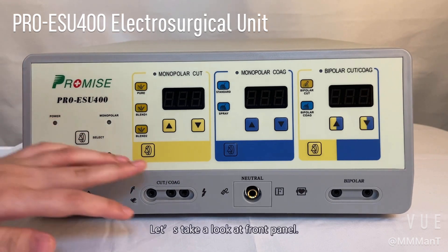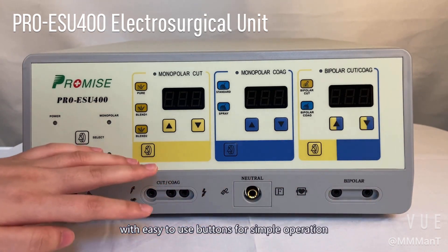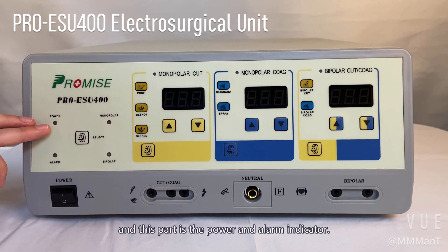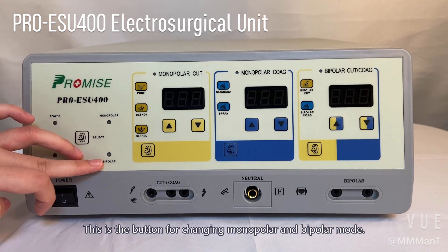Now let's take a look at the front panel. We can see there are three main areas here with easy-to-use buttons for simple operation. This part is for the power and alarm indicator, and this is the button for changing monopolar and bipolar mode.